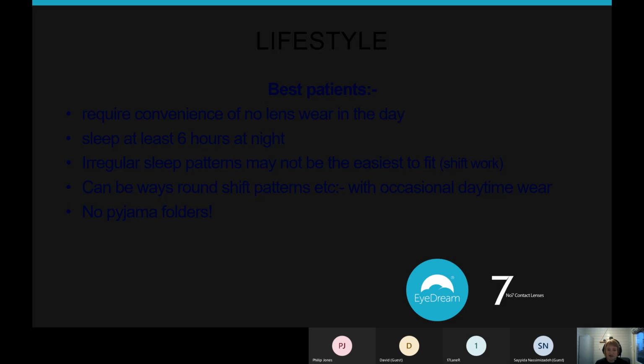The problem with daytime wear is that you get all the issues of movement and lid hitch. So you get lid hitch and then movement after blink and gravity causing that lens to drop, so the lens becomes mobile. And that can blur your topography pattern quite significantly. So it makes it much harder for you and us at number 7 to judge the position of that lens.